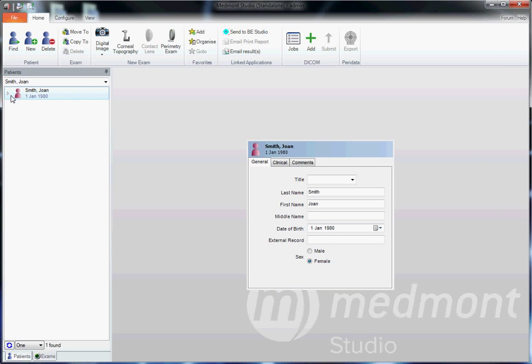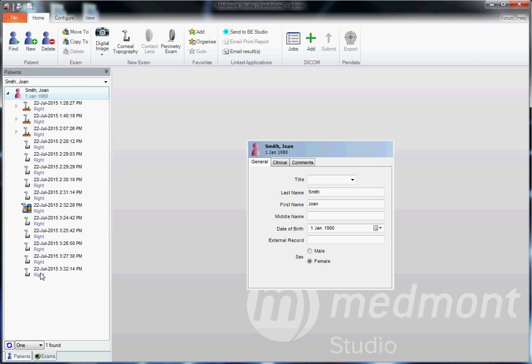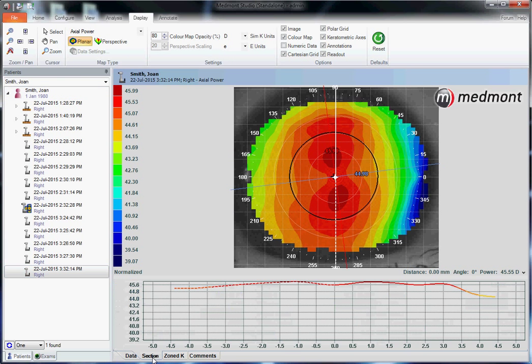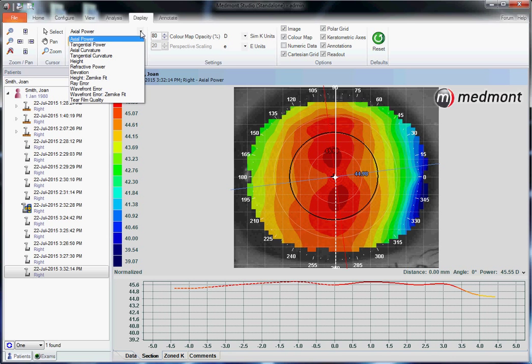If we open up this patient file, we can select that image we just took. We can go up to display and analyze this eye in axial power. Axial is the best way to interpret refraction or the power on the corneal surface.